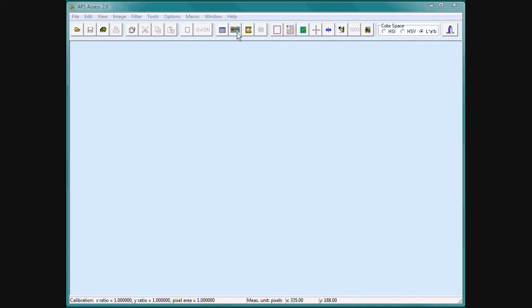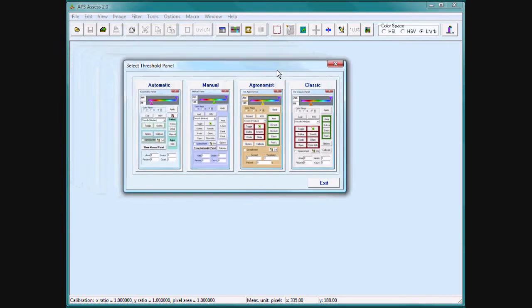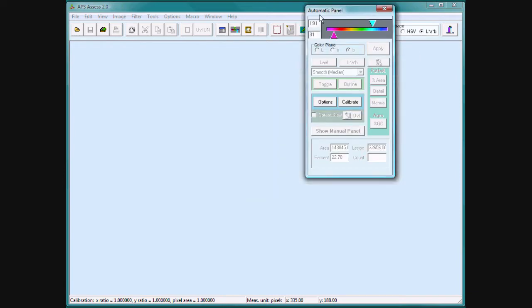It is as easy as choosing one of four threshold panels: automatic, manual, agronomist, or classic. I will choose automatic.